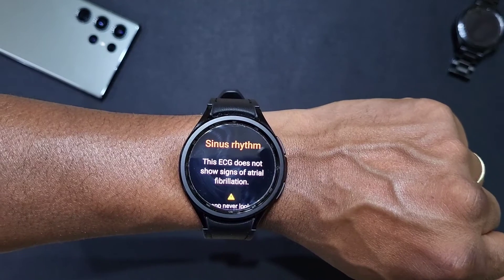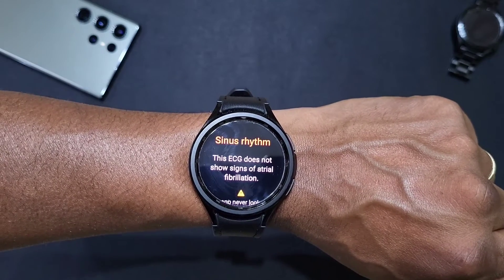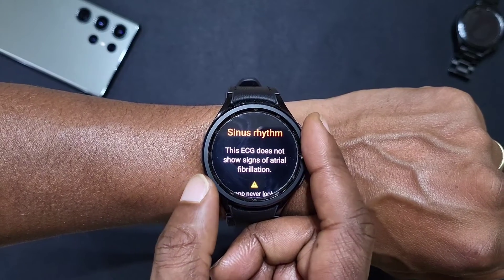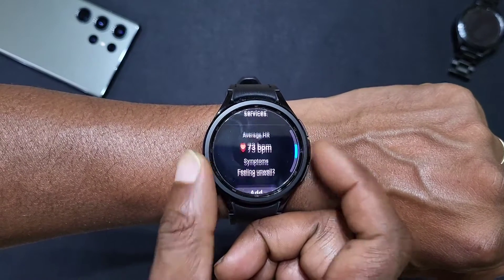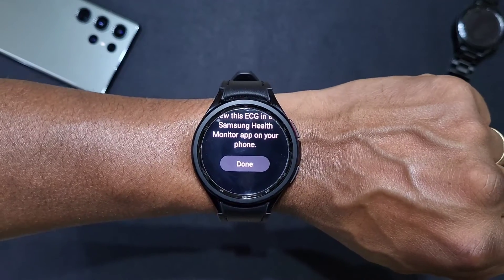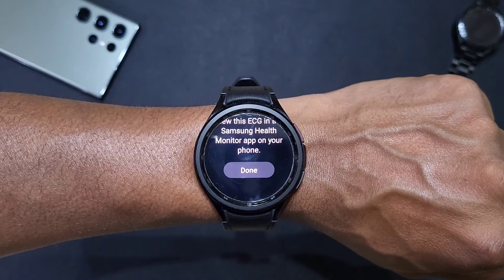As you can see while it was doing the checks you also got your beats per minute, and now it's done it just gives you your results. That's how you use the ECG function on your Galaxy Watch 6 and Watch 6 Classic.